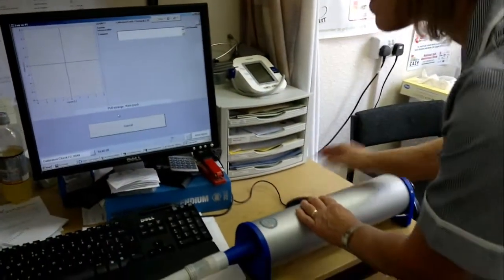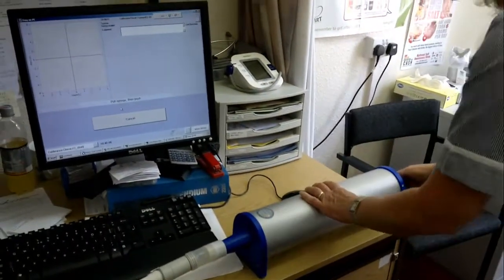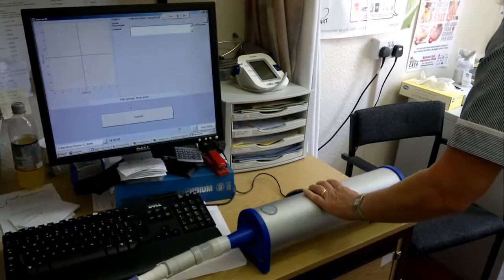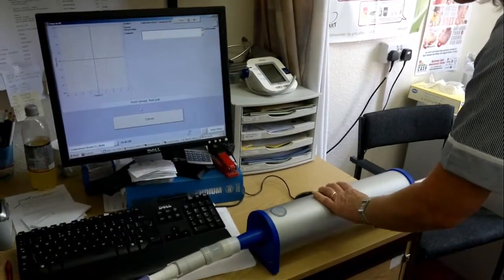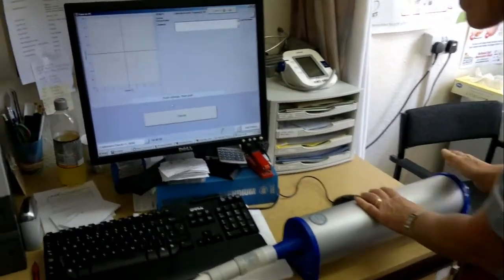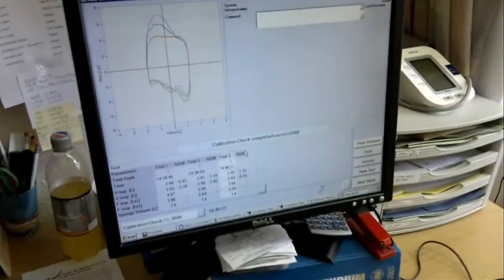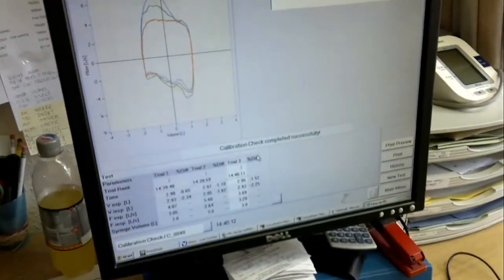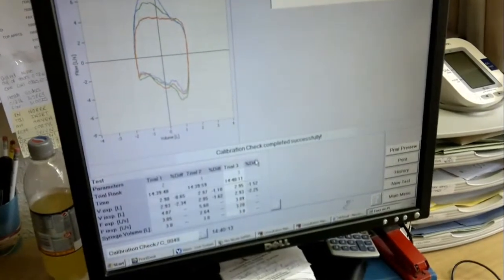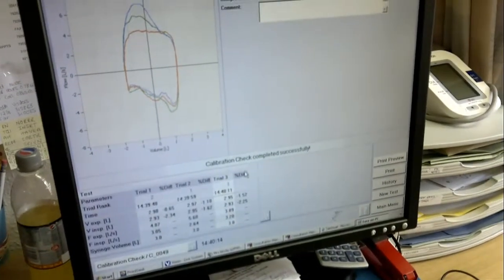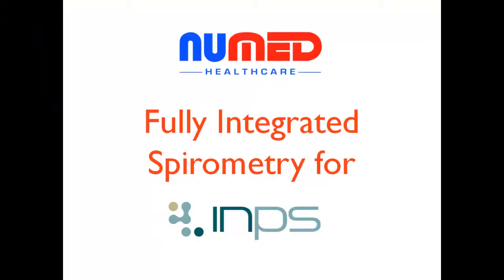Once we have performed the three tests, the software will tell us the device is calibrated and calibration is now complete.